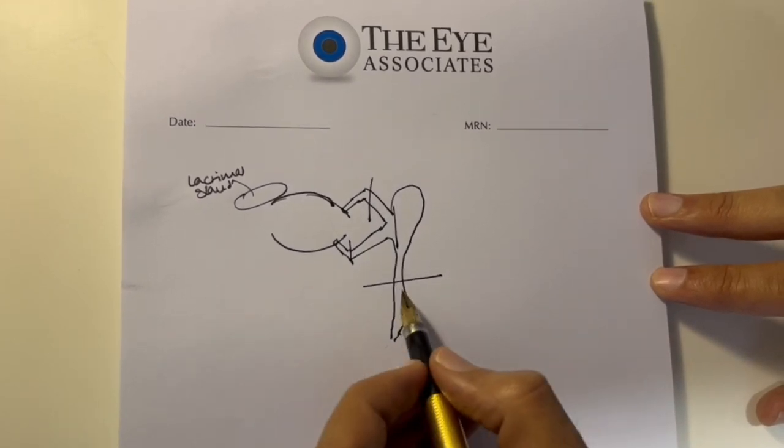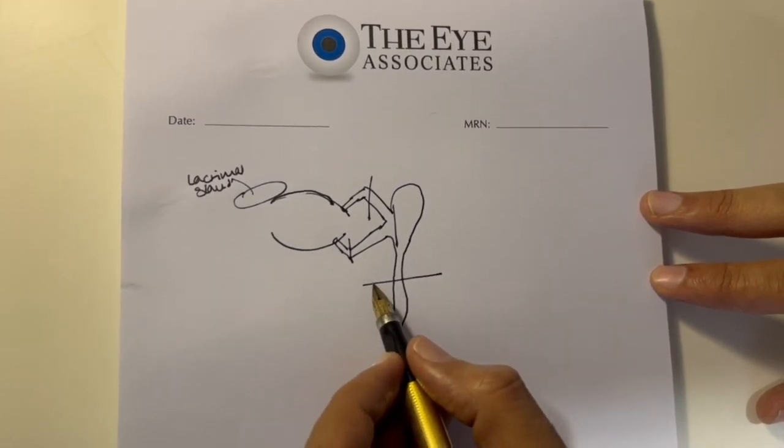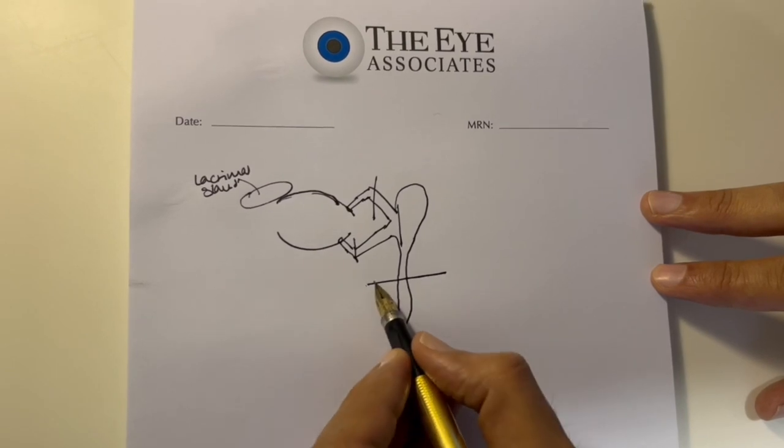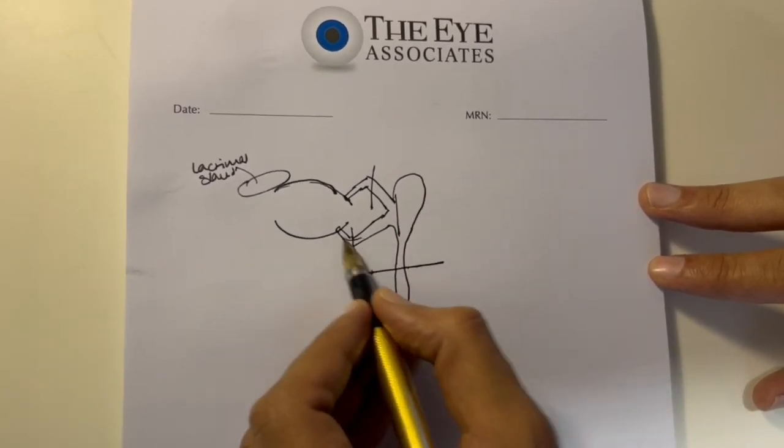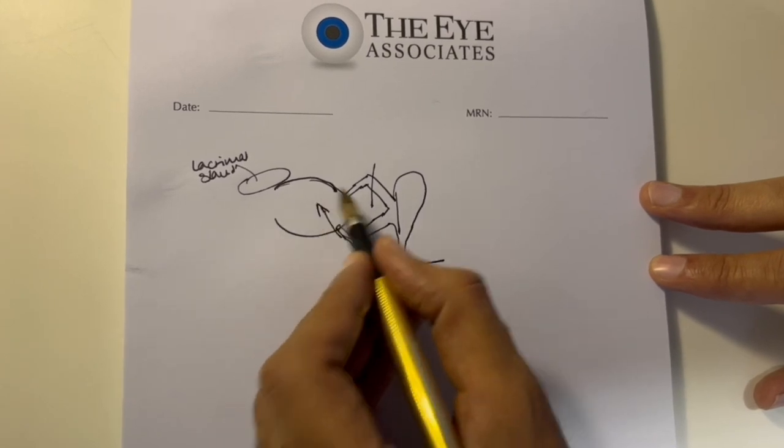Regurgitation testing: when the blockage is distal to the lacrimal sac, if you press the lacrimal sac, there is going to be some regurgitation of fluid out of the punctum. So when we are doing the examination, this is one of the key tests we perform.